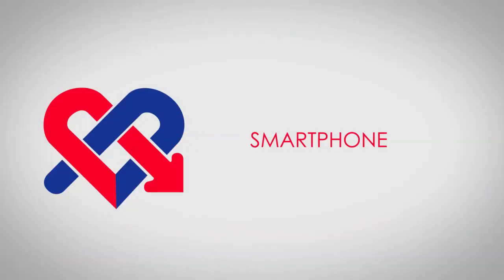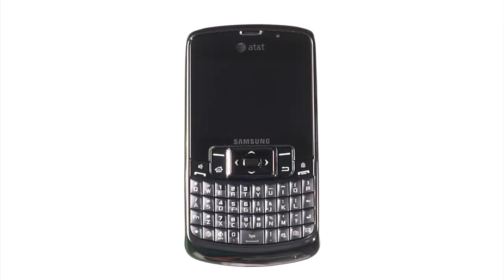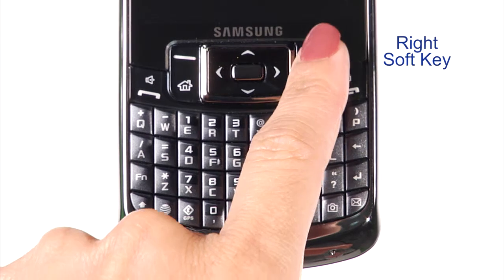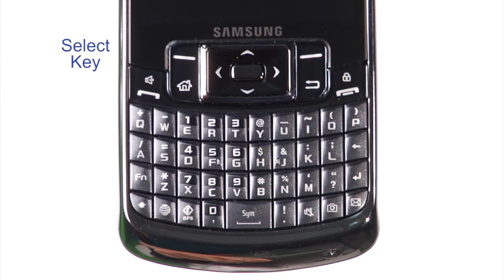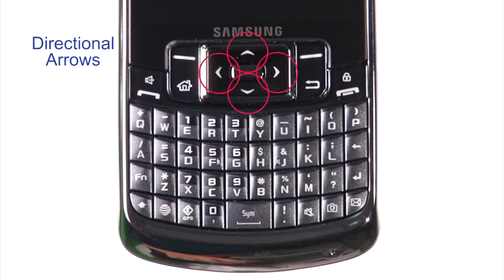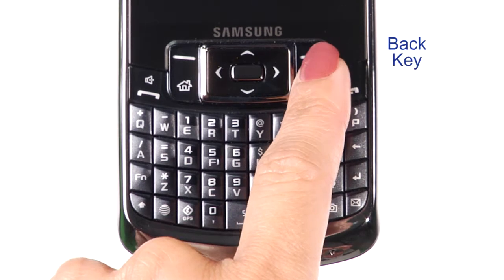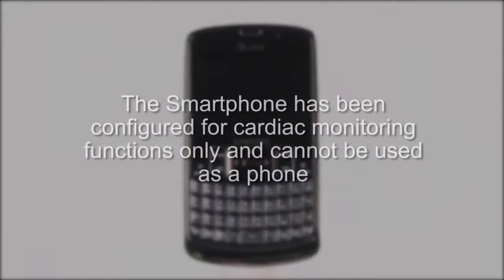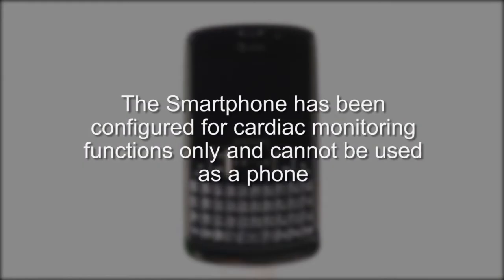Let's first become familiar with the Medicomp Smartphone. There are a few buttons you will use throughout your procedure: On/Off button, Left soft key, Right soft key, Select key, Directional arrows, and Back key. You'll also be using the charging port. The Smartphone has been configured for the cardiac monitoring functions only and cannot be used as a phone.